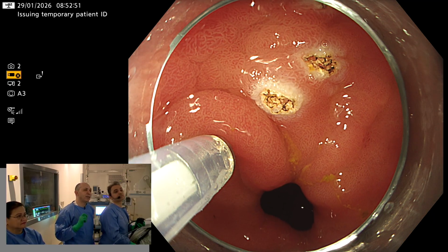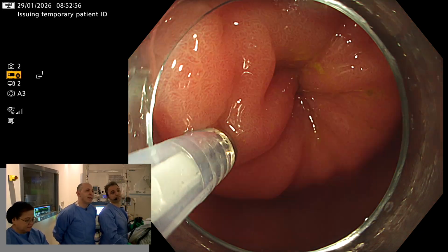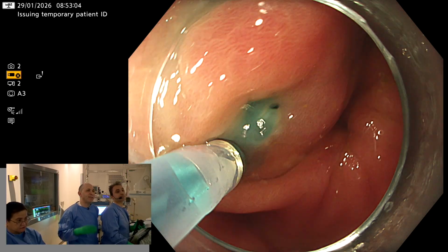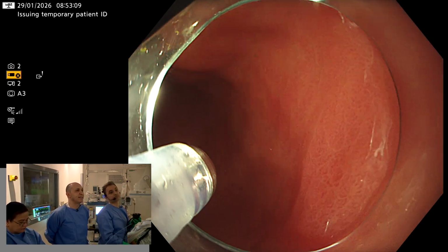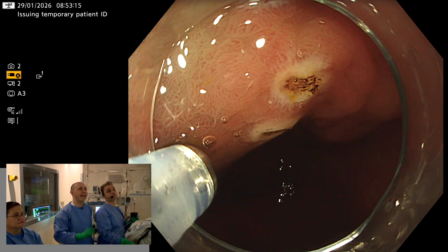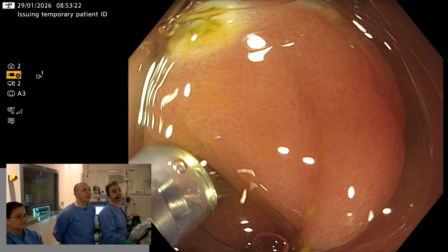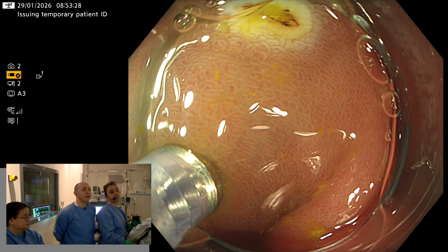First of all, in our strategy, we will inject submucosal methylene blue mixed with hyaluronic acid at the distal part of the lesion close to the pyloric area. Needle in. And this will make the lesion elevated and get closer to the scope into the gastric side. Of course, this will facilitate making an incision for our endpoints at the pyloric margin. And as we see, the point of injection is very, very crucial.